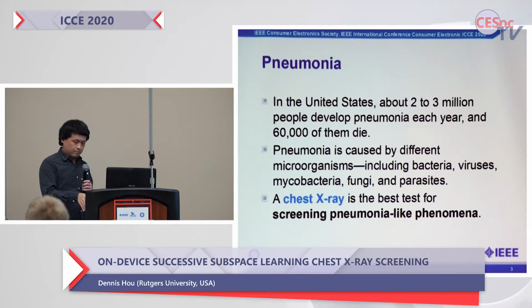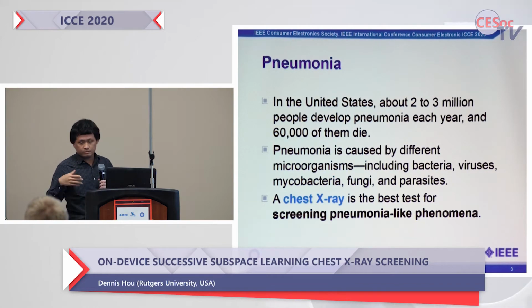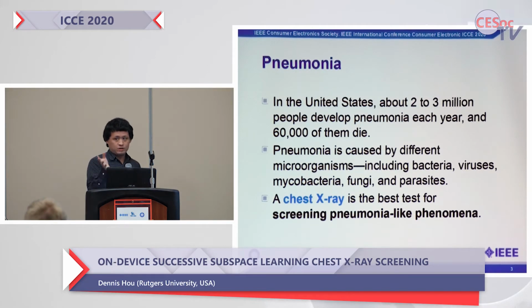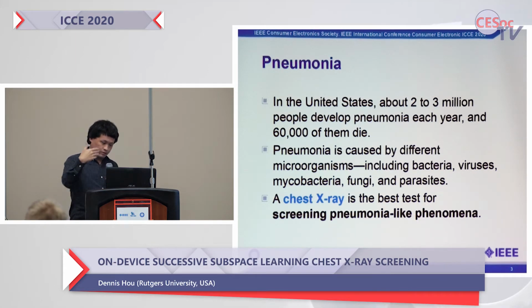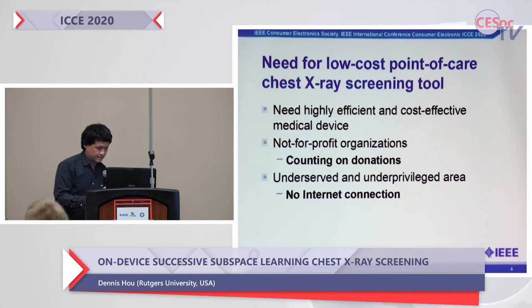Plus you have other diseases that present very similarly, such as Legionnaires or SARS, et cetera. So we're restricting ourselves to image classification and detection of what looks like pneumonia, but that's not enough for a diagnosis. I just want to be clear that this is not a full diagnostic tool in that sense.